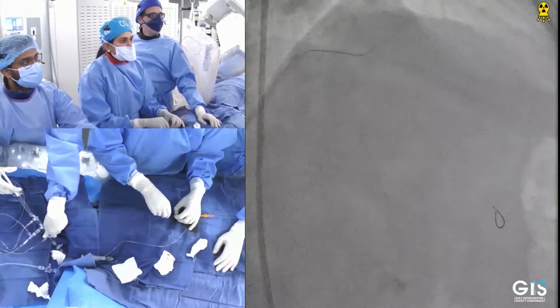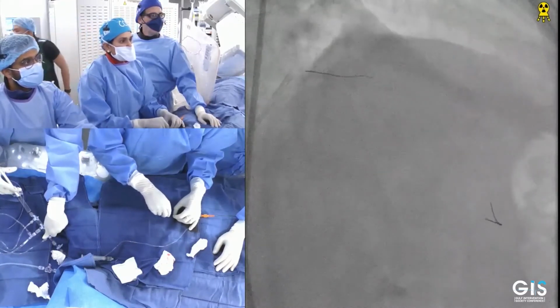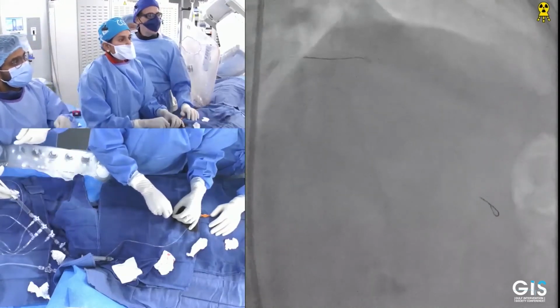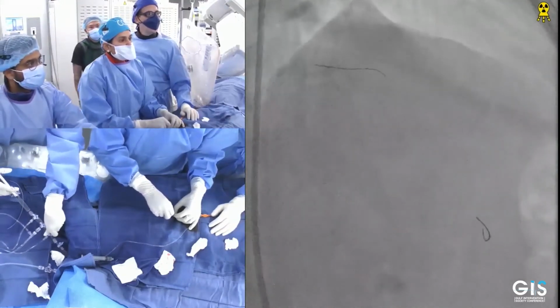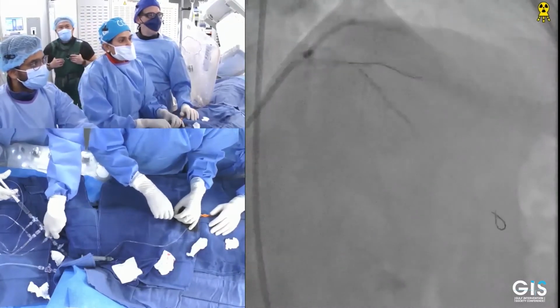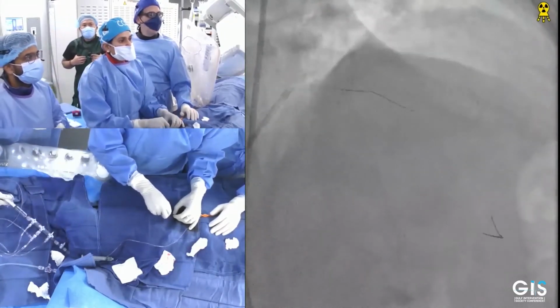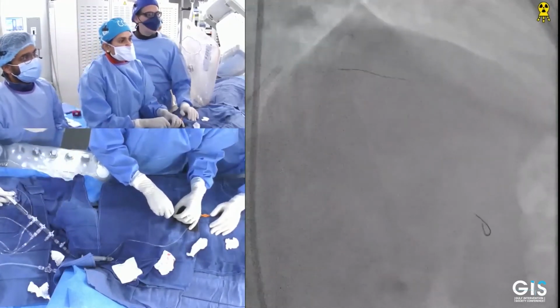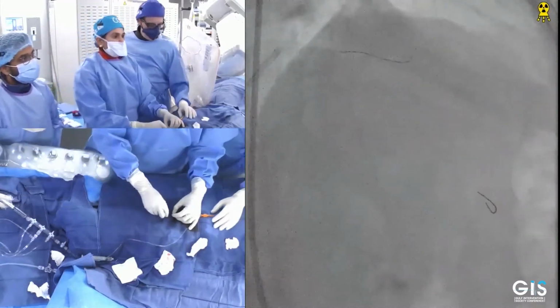Oh, good. Okay, excellent. Now we took this very small branch. After you make the top, you have to make a right, and then you have to go left again to go there. I think we're good over there.